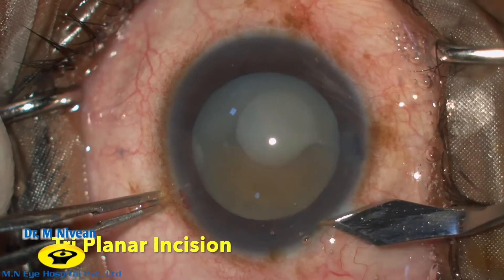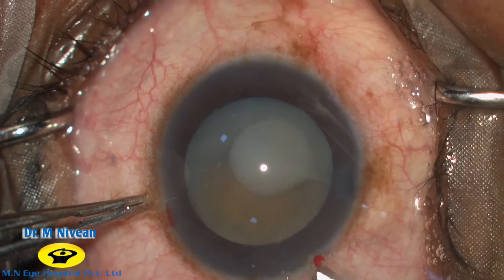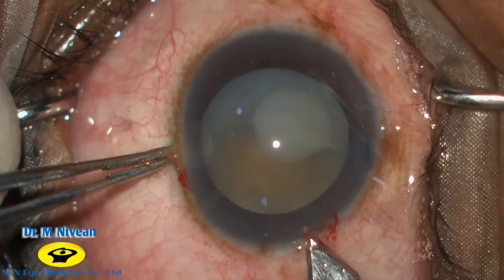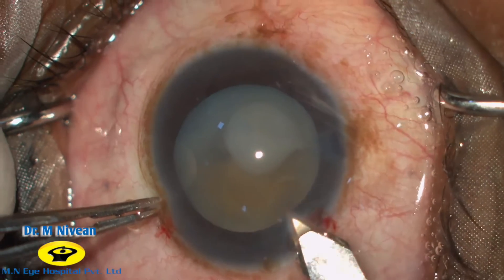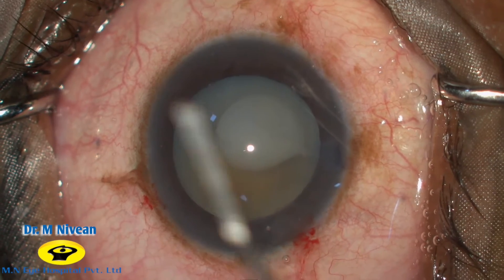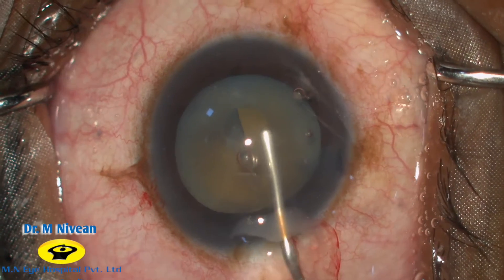Making an incision at the limbus, a 2.8 mm keratome is used to create a triplanar corneal entry into the anterior chamber. Viscoelastic is injected to get a clearer view and to flatten the anterior capsular flap.